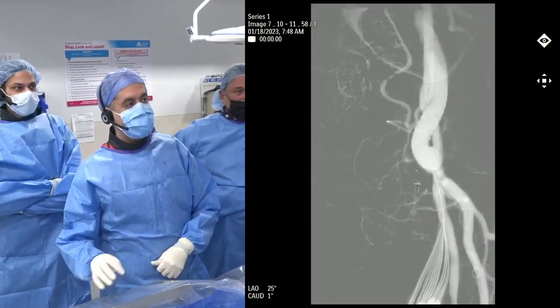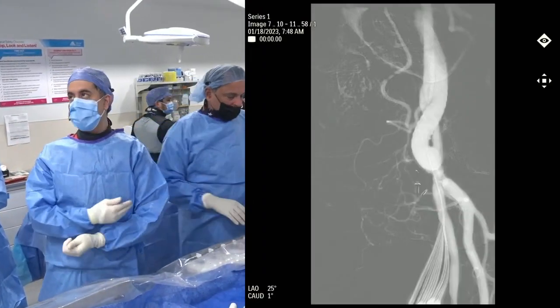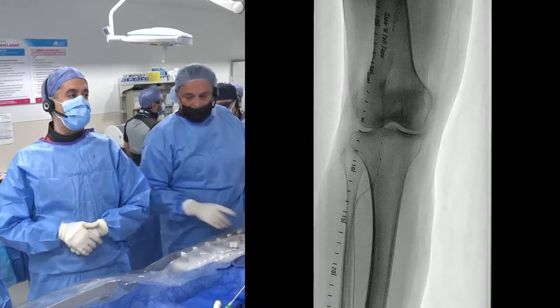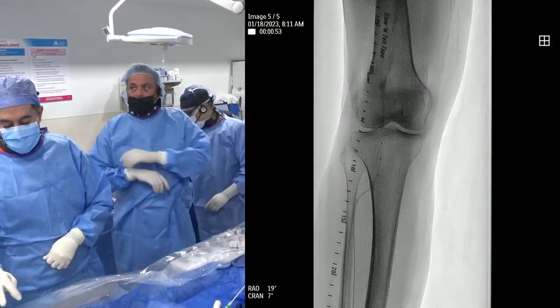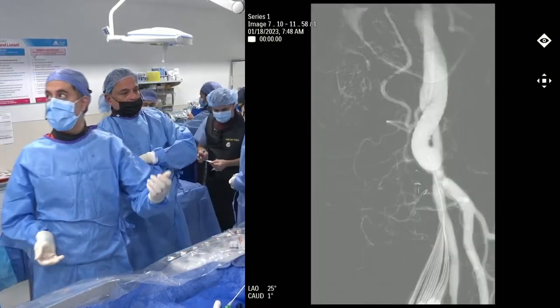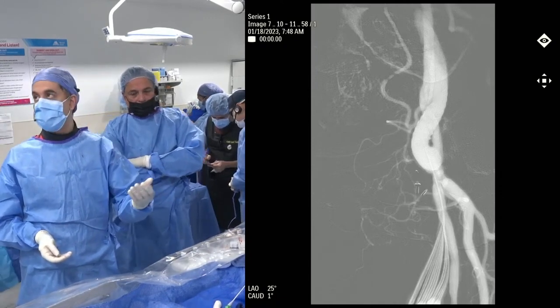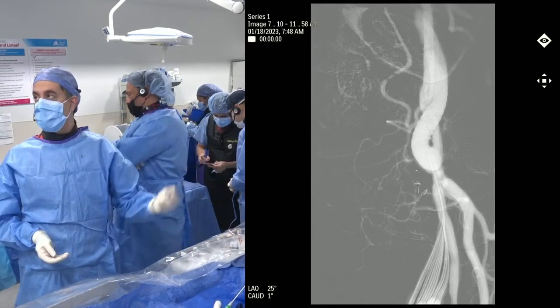Yeah. So we decided to go, with the complexity, no left radial, no ulnar, and a high-grade stenosis at the left subclavian. We really had restricted options to get the diagnostic pictures, which Srini was talking about, the imaging. So we took an ultrasound-guided access. The idea here was to keep the lumen size as low as possible, so we thought about doing just a 4-French access system to visualize our vessel.